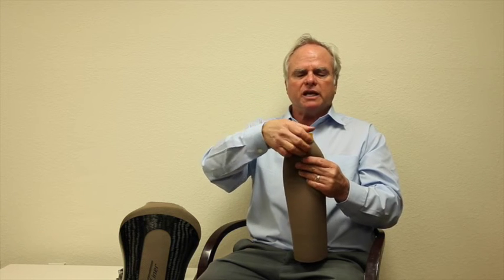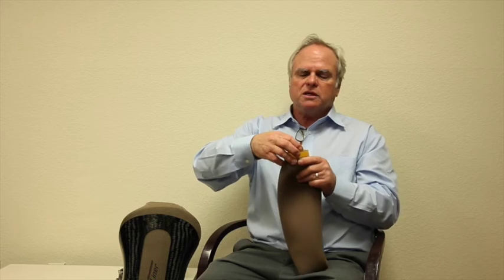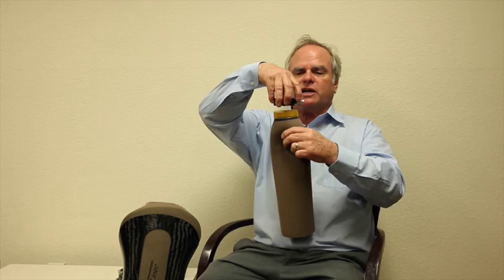and this screws into any liner, remember, so you can hook that up with anybody. And then you can put the dummy on top and do your lamination. Okay? Now, just a little word of caution. There are so many designs of the nipple on the pin liners. We couldn't make an adapter for everyone. So these will get you close. You might have to do a little fill. The most important part is that you don't have an undercut.